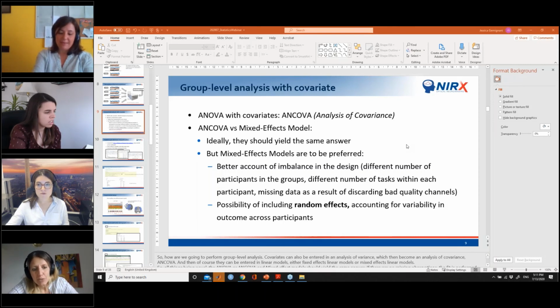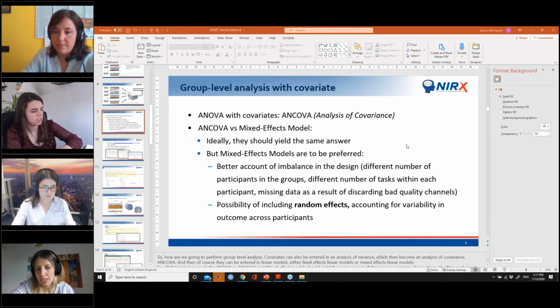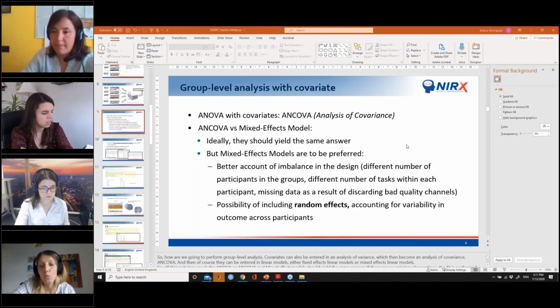So the next one would be: subjects have 3 different runs, and between the runs, NIRS was calibrated, so we have independent data sets. Basically they redid calibration for one subject, and they have 3 different recordings with different calibration values. What they're asking is if runs can be compared among each other, for example run 1 versus run 2 using fixed effects, and if fixed effects is available in Brain Analyzer.